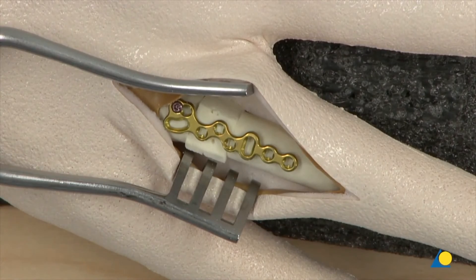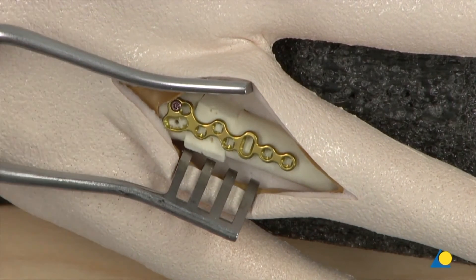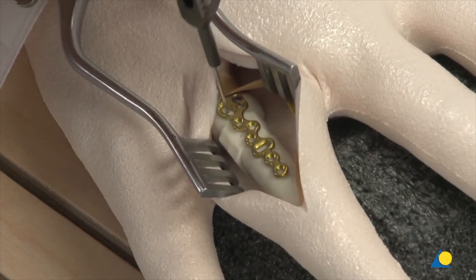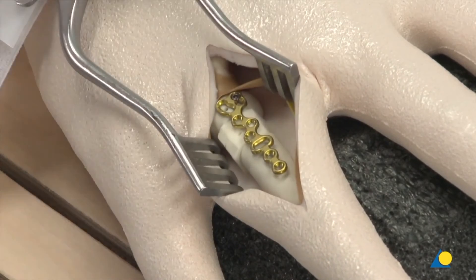The cortex screw is inserted through the longitudinal hole of the plate head using the 1.1 double drill sleeve and 1.1 mm drill bit.